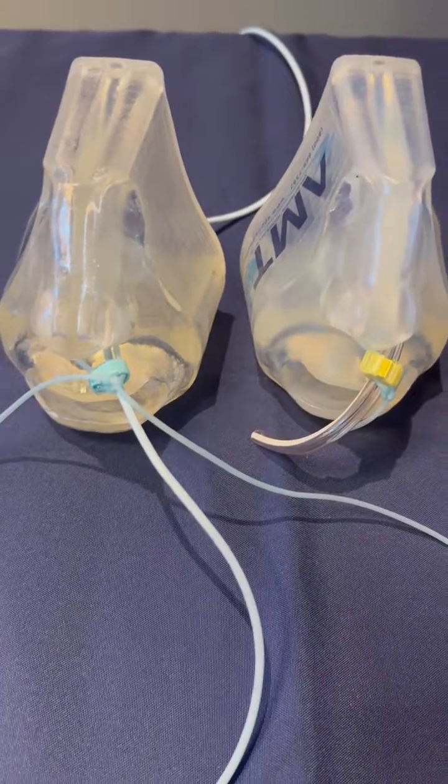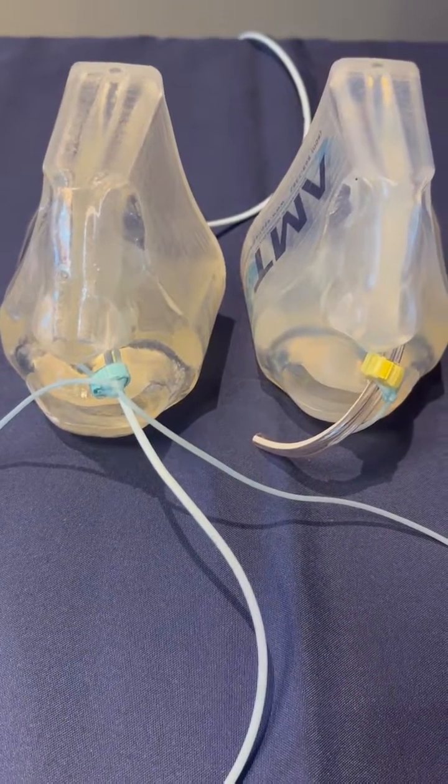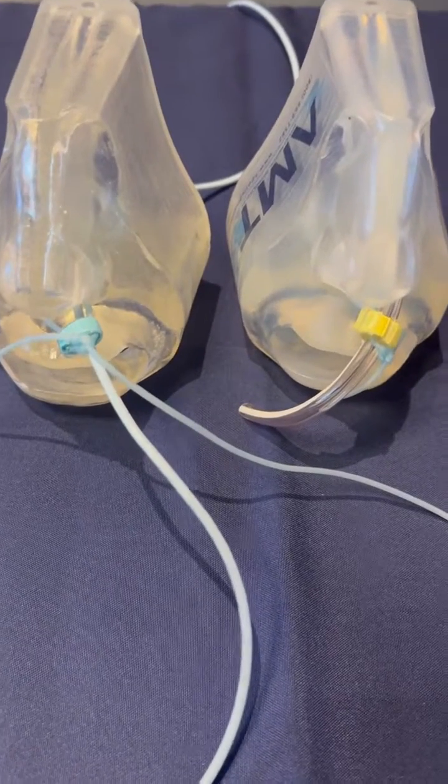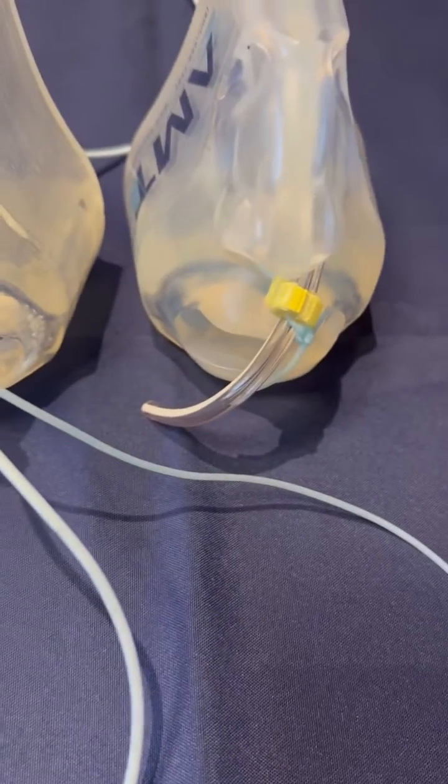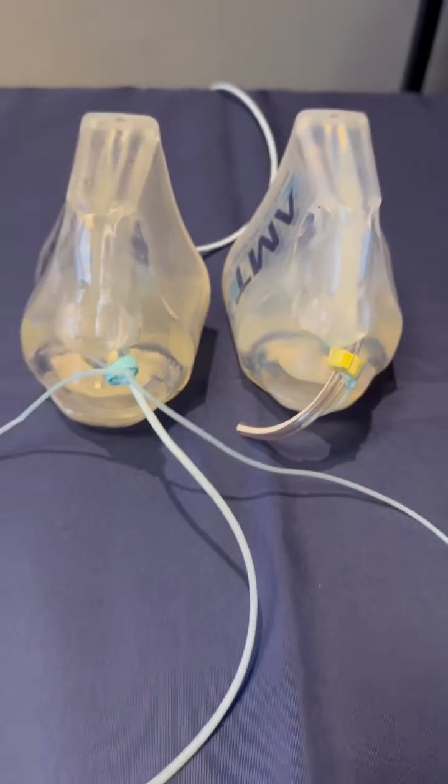Use of these fasteners have decreased tube dislodgements or tube pulls by 74%. On the left I've got a feeding tube and on the right I've got a gastric tube. I just want to show you what's out there.